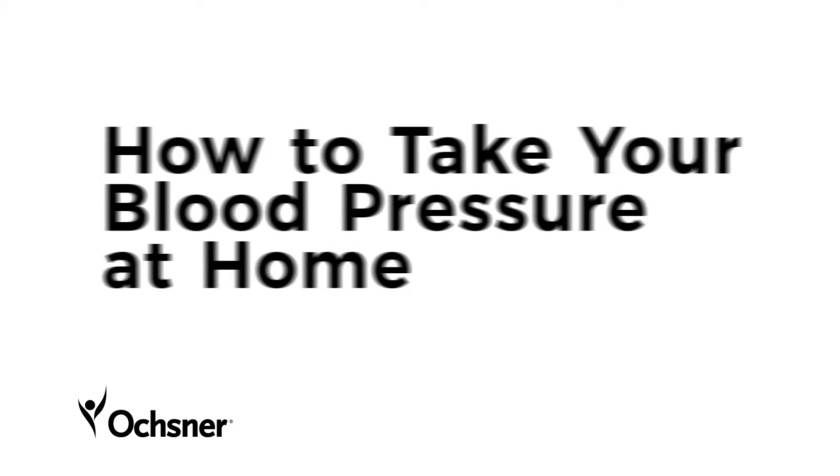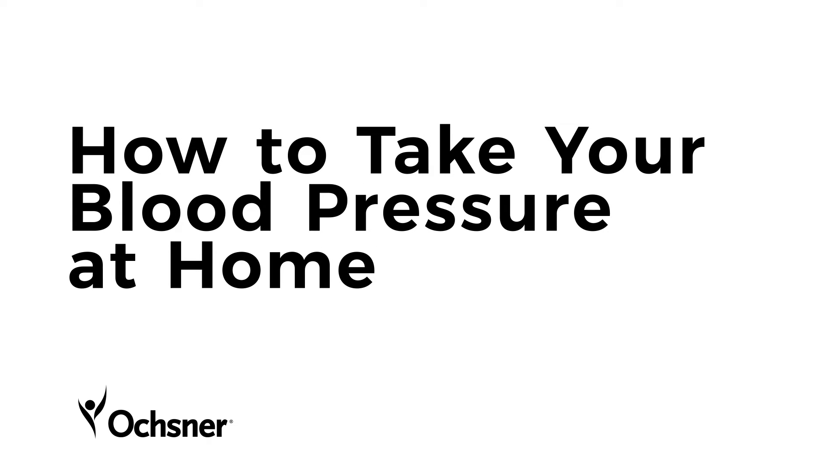Taking your blood pressure at home is an easy and convenient process but does require a few steps. Here's exactly what you need to do to take your own blood pressure at home.